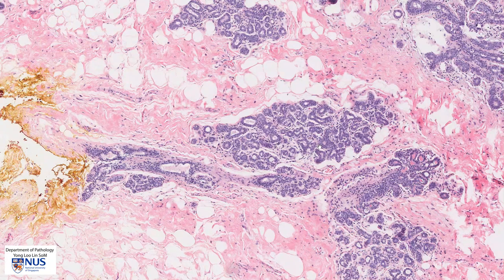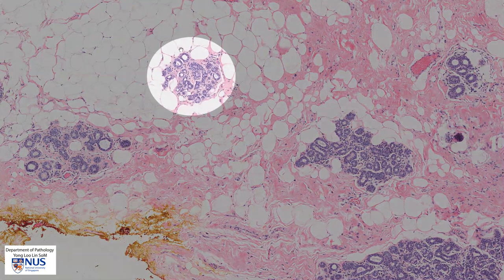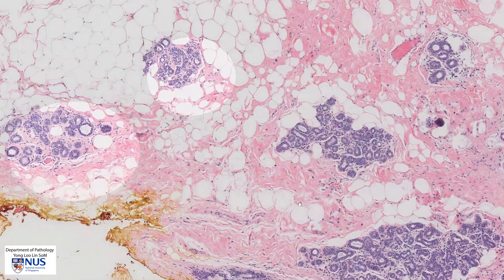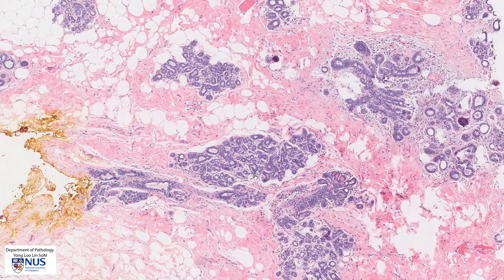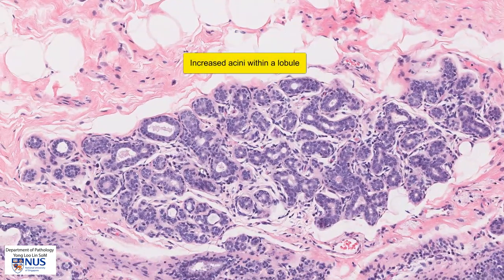Let's take a look at each individual component, starting with adenosis since we are already in this field. If we look at a regular lobule, you will see a certain number of acinar structures or profiles. In this area, it seems to have a little bit more of these acinar structures. This is a benign finding with no significant architectural atypia or nuclear atypia.